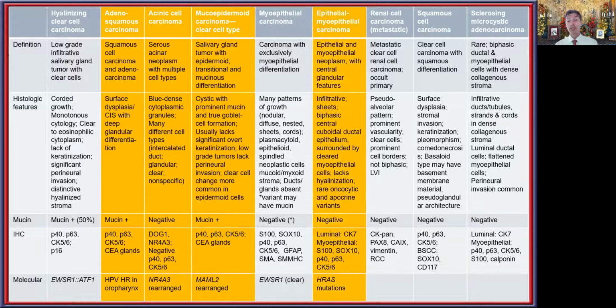And let me just show these to you now, where you can see a strong and diffuse pan-cytokeratin, strong and diffuse P40 in this example, a little bit more patchy with the CK56, but again, you can tell that it is highlighting the majority of the neoplastic cells. Calponin as an example of smooth muscle, very nicely reacting in this example. S100 giving you both a nuclear and cytoplasmic reaction, and then a very nice and prominent reactivity with SOX10.